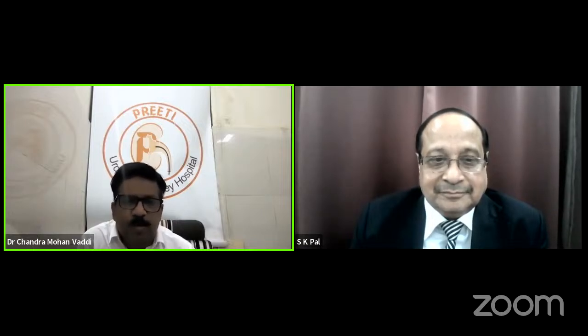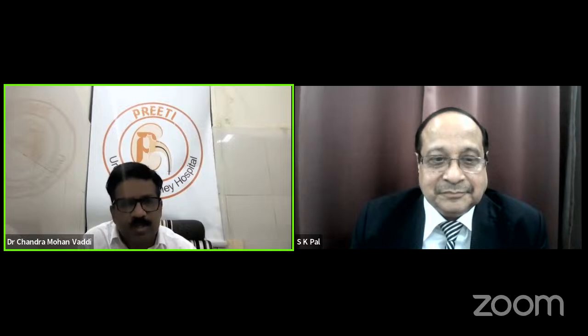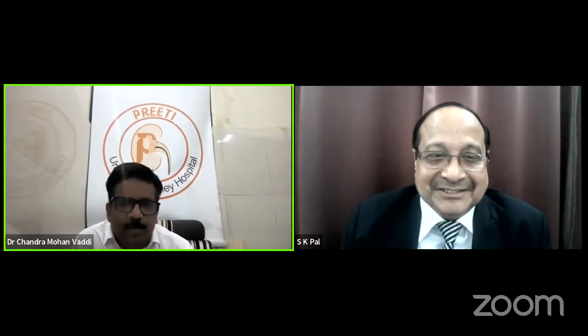Overall, it took 45 minutes. If I have done dilatation up to 18 French, oh, much better. In fact, 22 by 18 is luxury. So are we still favoring the 12 French nephroscope, let it be any company?